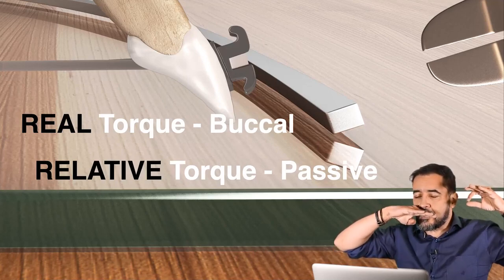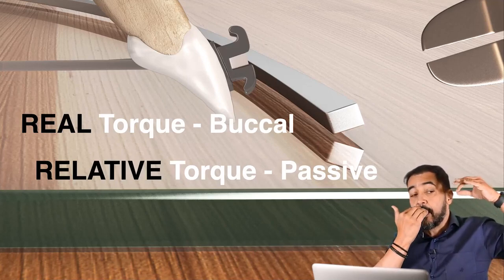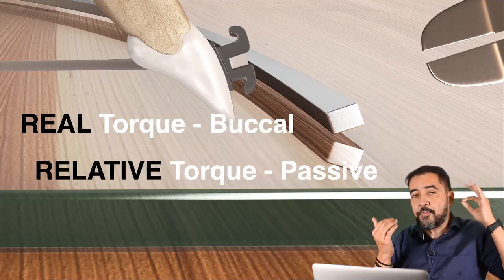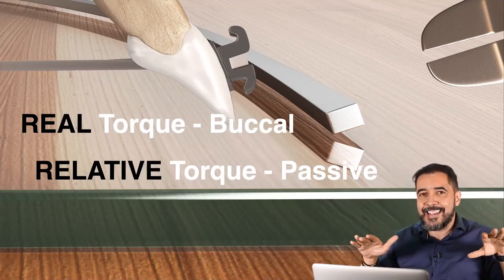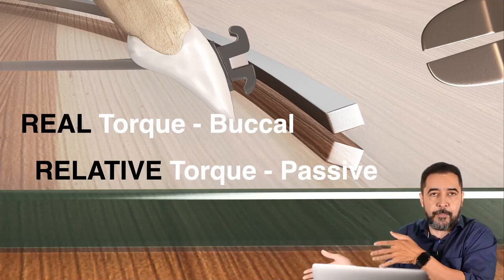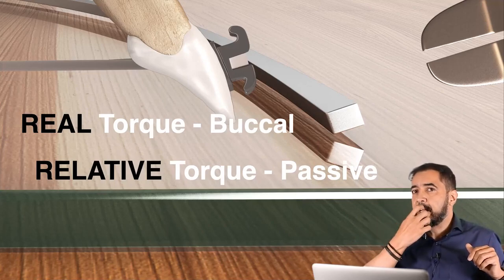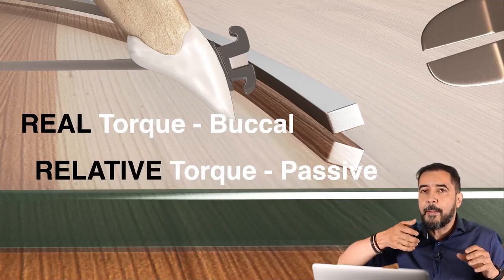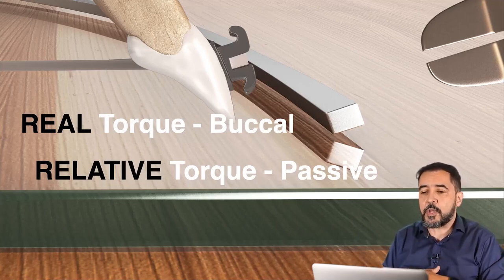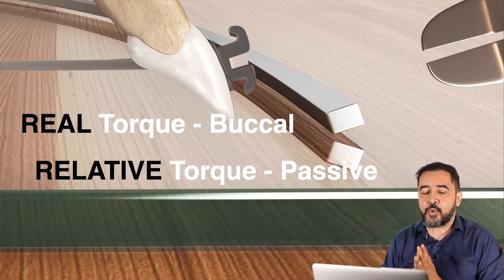You do this inside the anterior slots, the anterior teeth, and you see in which position it will pass. If you don't want to have an active interaction, if you don't want to generate a couple and of course an inclination because of that, you need to do this passive relative torque.